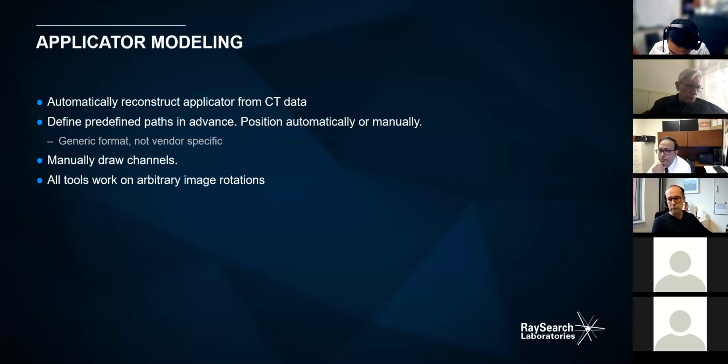Hey guys, sorry I joined a little late, but we are looking at Parasolids. These are generated from SolidWorks or Pro/E, I assume, and are proprietary for Elekta or Varian or whichever. I don't know if you have negotiated for them to bring those in, because it's not just the external surface, it actually models everything, the screws, the cavities.